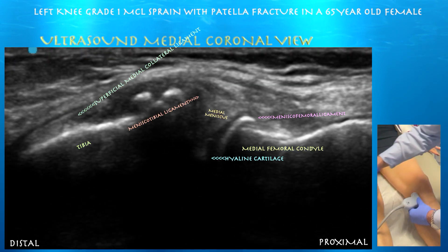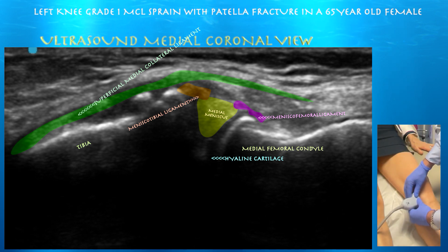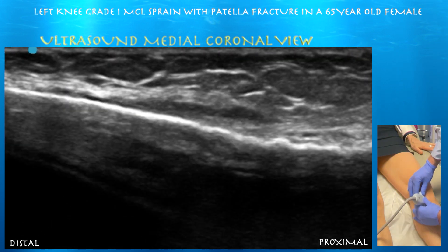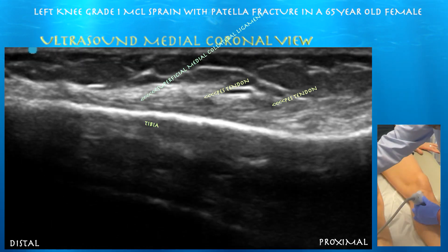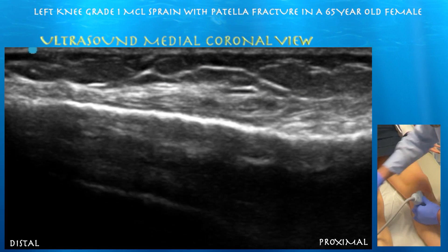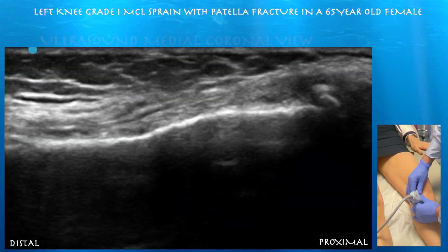And then you can appreciate the MCL inserting onto the tibia. We can see some nice strainy fibers going down. Here you can see some of the pes tendons, I believe, overlying the distal aspect of the superficial MCL — maybe some of the pes tendons in anisotropy, but hard to really say.